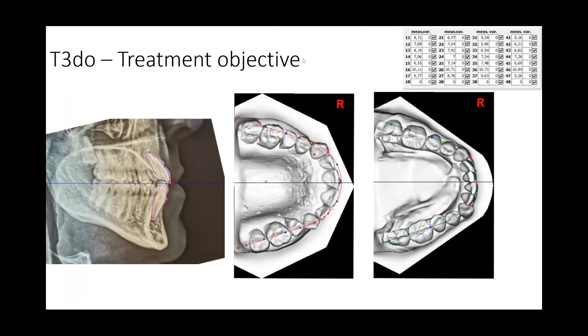Should I open the occlusogram? As you like. I mean, if we have to modify it, yes. But for now, I would say it's okay. We can also see it like that. In the first place, I decided that I need a space opening on the left side for an implant. So that's why I put here the measurement chart.